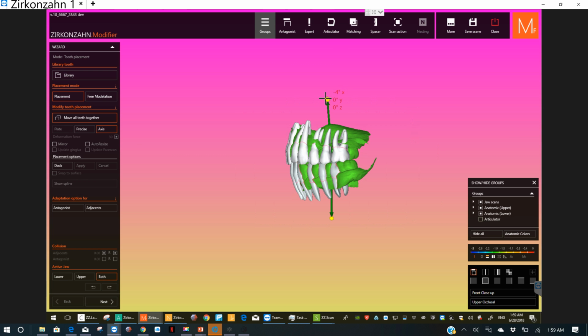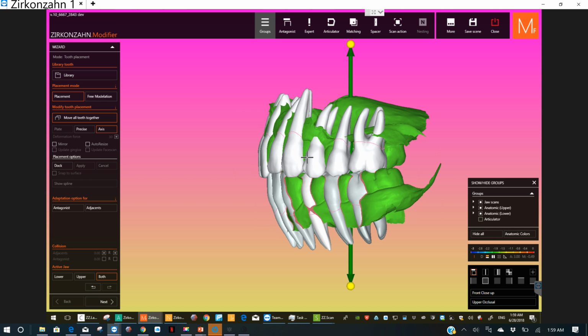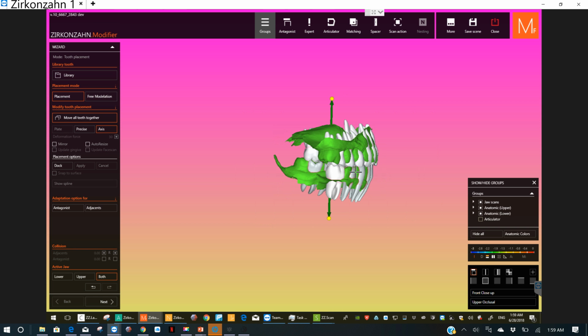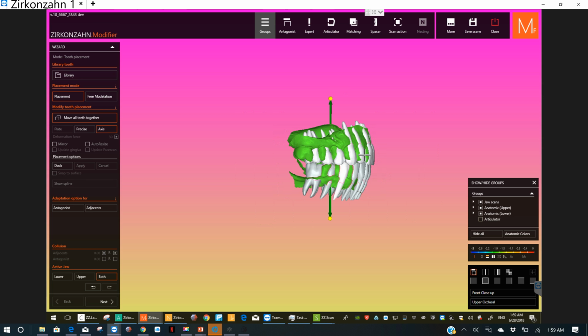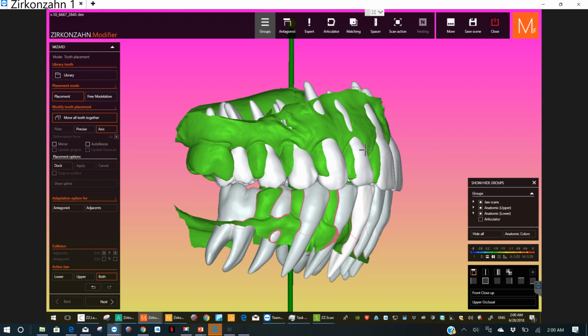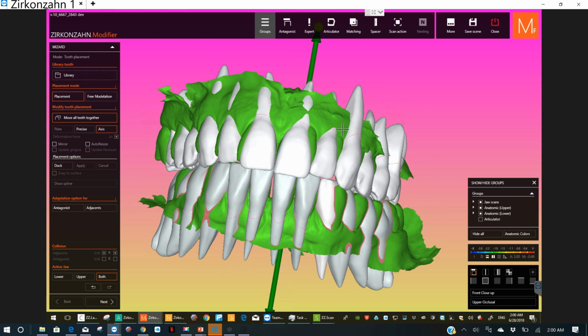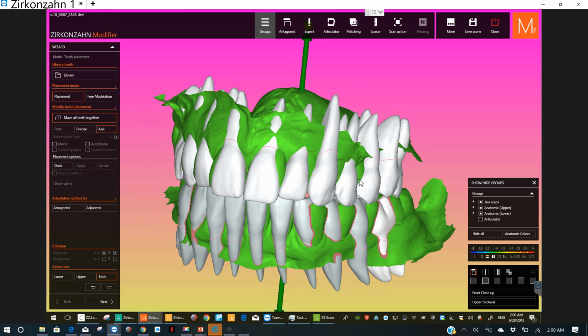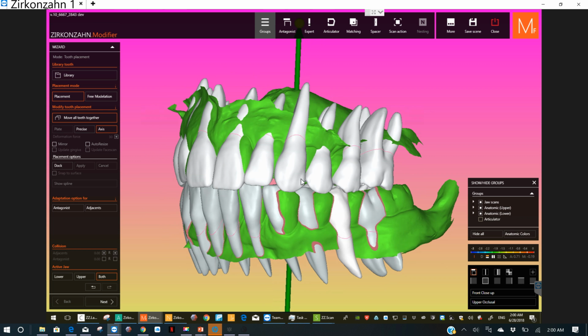Most of our cases need to curve this way a little bit because of the bone loss. We have to make the teeth kind of curve into where the implants are, so we have to cheat that way a little bit. If you do it smoothly, you kind of want the gum line to maybe disappear right there, but I'm not too worried about that. The fact that this bulks out right here, she has tremendous bone loss right there and missing teeth.